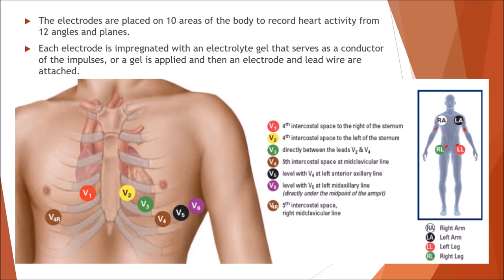Again, I prefer placing them on the lower abdomen than having to place them all the way up here. That way all my leads are right here on this area. So those are the easy ones. Again, right arm or left arm, a right leg and a left leg.